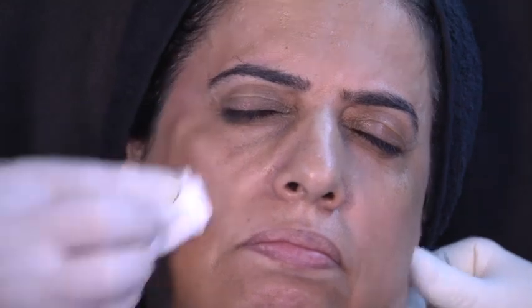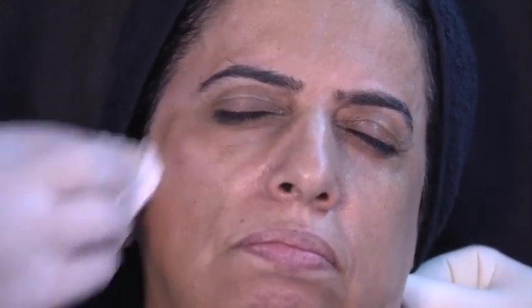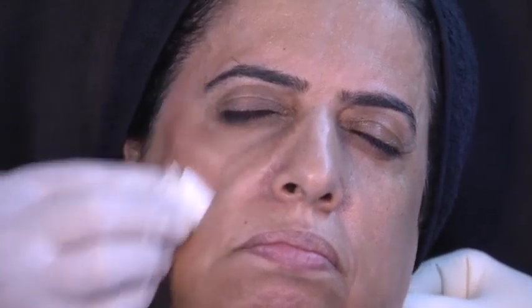Actually, this is her bone, okay? Now we are going to create a little bit of smoother transition, okay? Second point, same area, a little bit lower. We could do this with a cannula as well, I agree. 0.25, that's our second point.